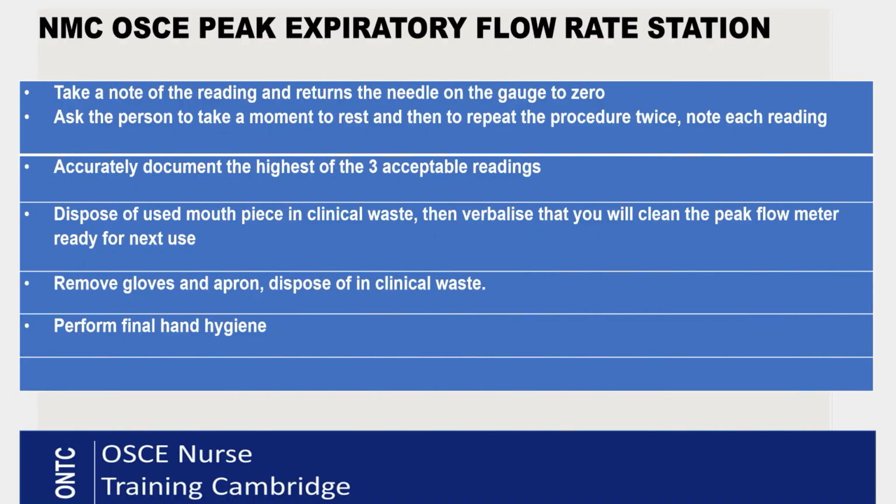So once you have given the instruction and your patient has done the first reading, your assessor, obviously the mannequin can't blow into the peak flow meter, so the assessor will tell you, assume your first reading is done, and they will give you your first reading to put on your chart. So go ahead and straight away document the first reading.